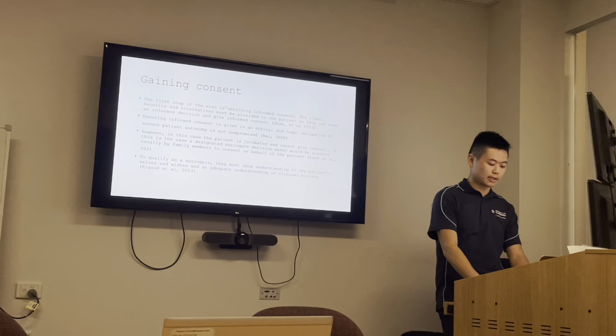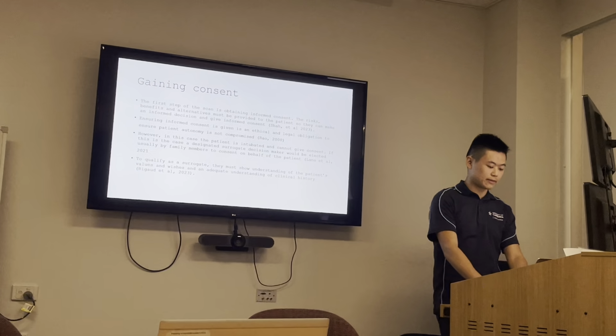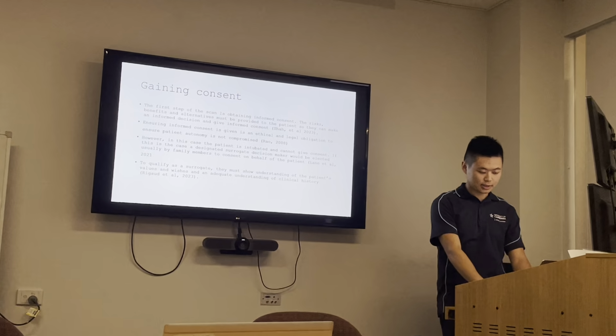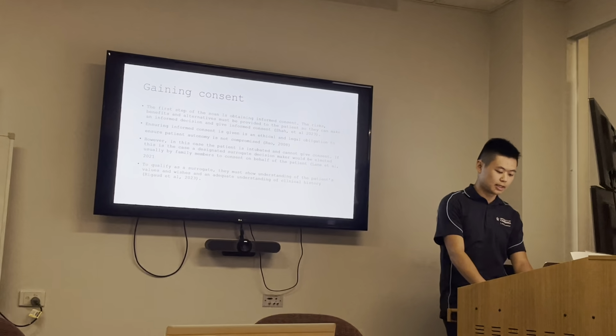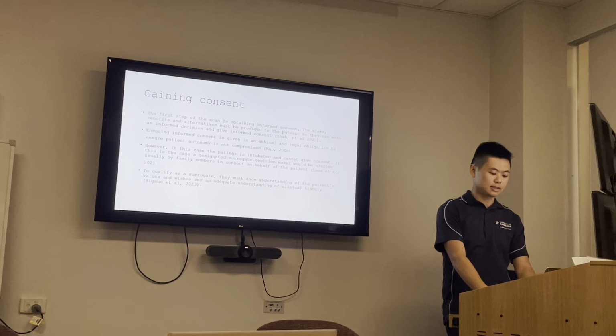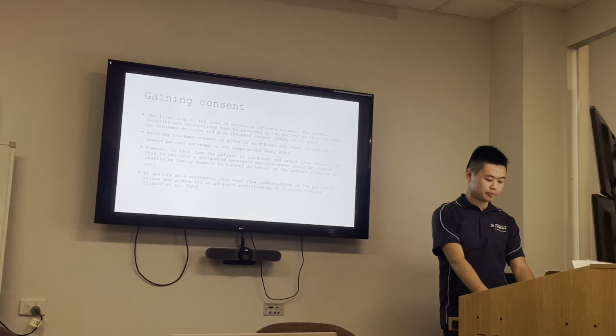Okay, so the first step of an MRI is gaining consent. So you have to explain the risks, benefits, and alternatives to the patient so they can make an informed decision and give the informed consent. Ensuring that informed consent is covered is an ethical and legal obligation to ensure patient autonomy is not compromised.